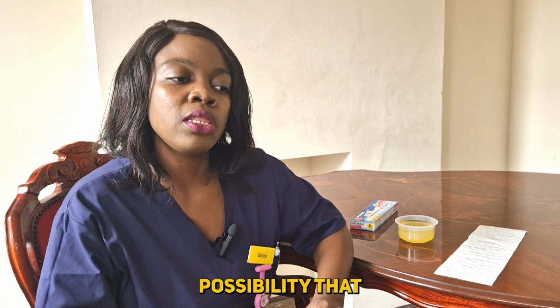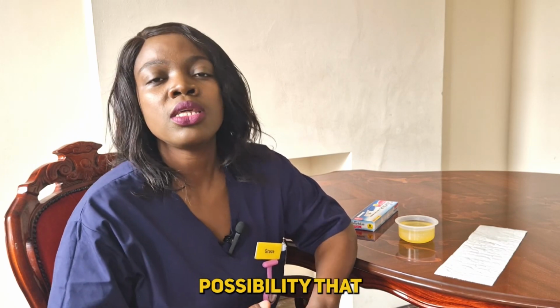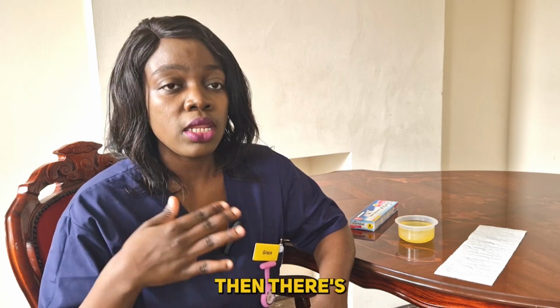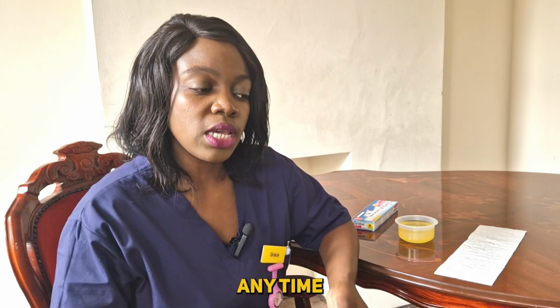And there's a high possibility that the urine has been staying in your bladder for up to more than 6 hours. Then there's a high possibility that your urine is going to be concentrated of the HCG. And if you test, then there's a high possibility that it may turn positive. So another thing, you can also do it any day, any time of the day.